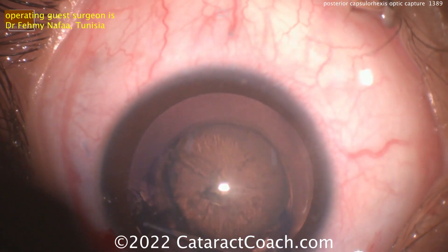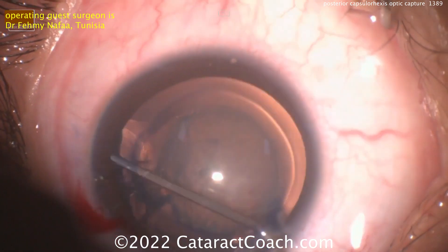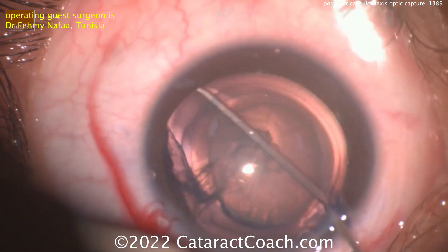In this case, you're going to see the optic is going to go actually behind the posterior capsulorexis.